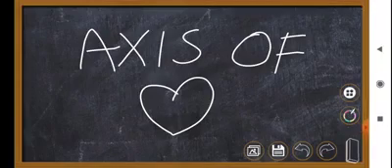So, we all know there are 12 leads of an ECG, and there are 6 limb leads and 6 precordial leads. Limb leads are 1, 2, 3, AVR, AVL, and AVF. So, to determine the axis of the heart, we use lead 1 and lead AVF.